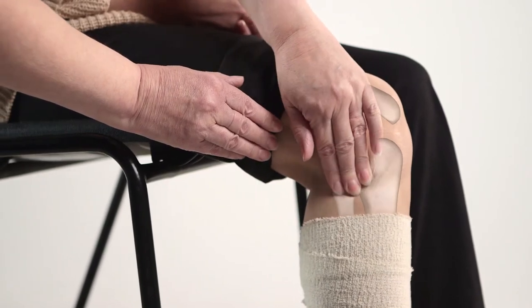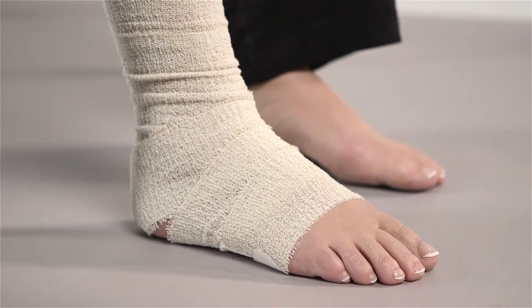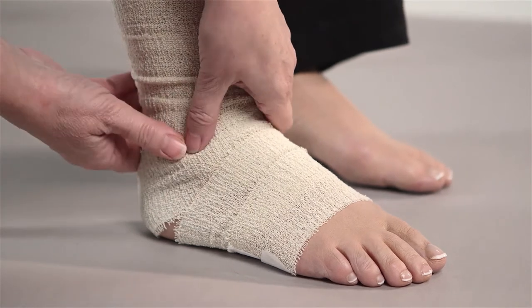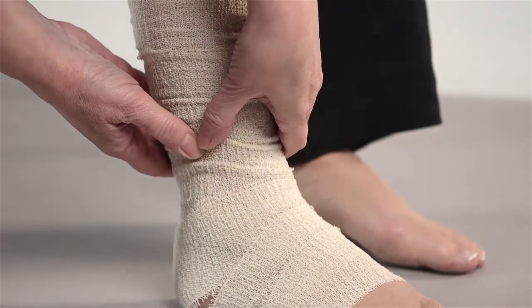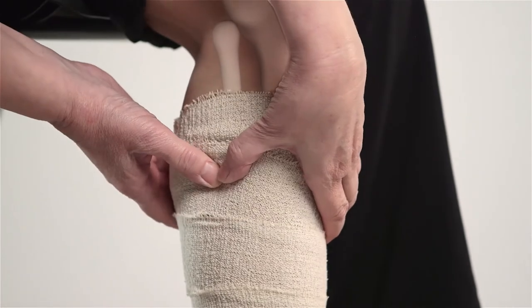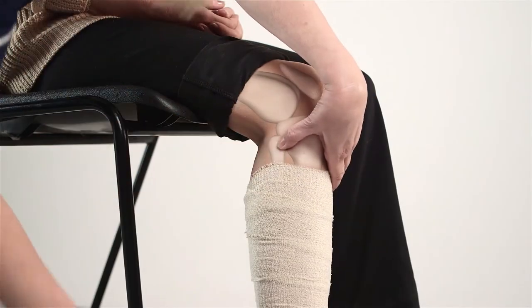Feel your way to the head of the fibula bone — it can be felt as a much larger and more rounded protrusion in comparison to the lateral condyle. Alternatively, locate the fibula head by placing your fingers on the ankle bone on the outside of the leg, and in the groove between the calf muscles and the muscles at the front of the leg. Run your fingers upwards towards the knee until you feel the round protrusion at the top of the fibula bone — the fibula head.